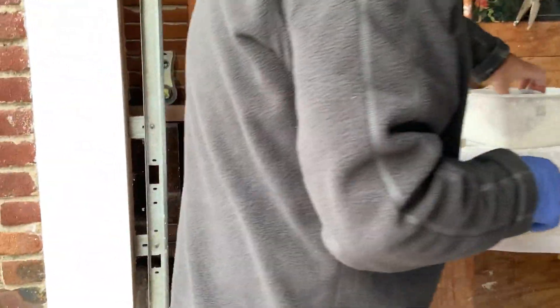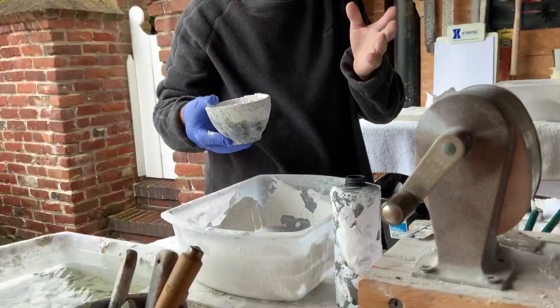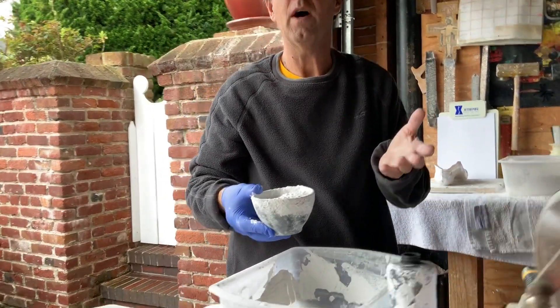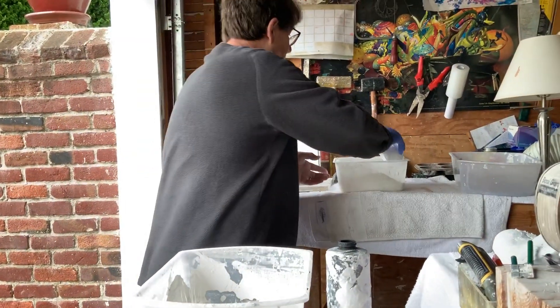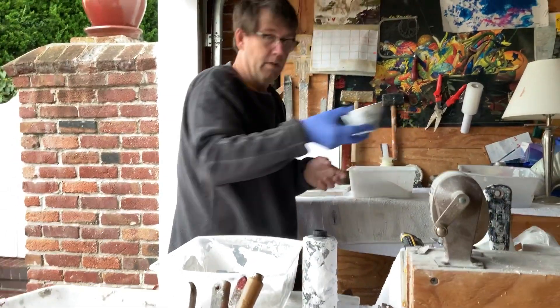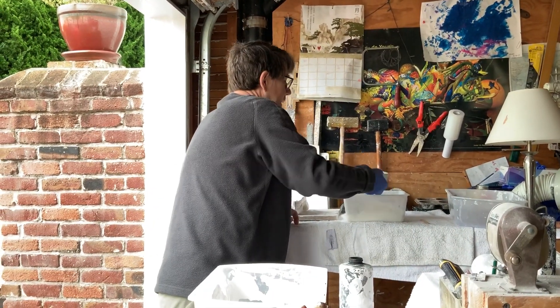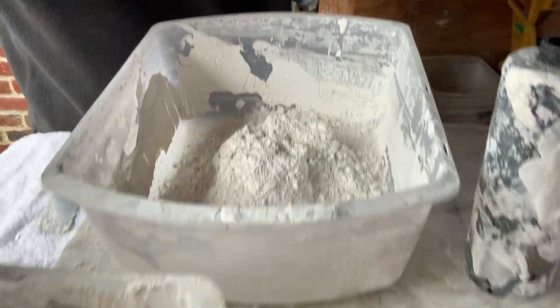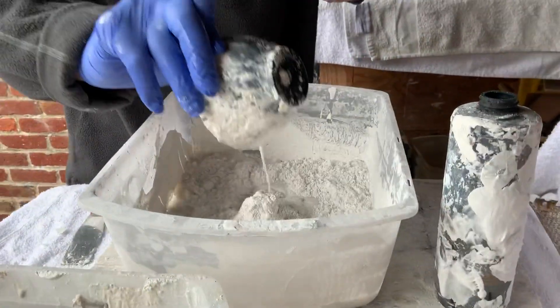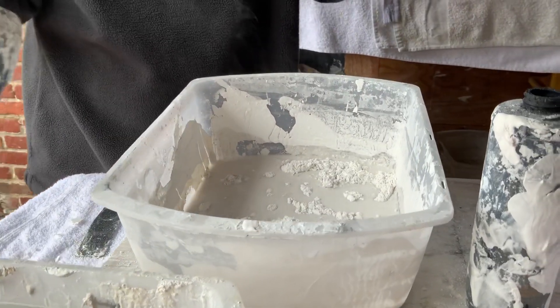So we take our casting powder. We need a 60% ratio of water to powder. We're going to use three cups of powder since it's just one foot, and about one and two thirds cups of water. That will give us a 60% ratio.